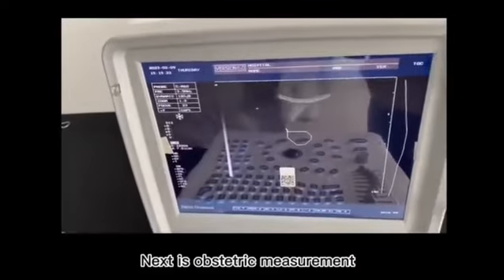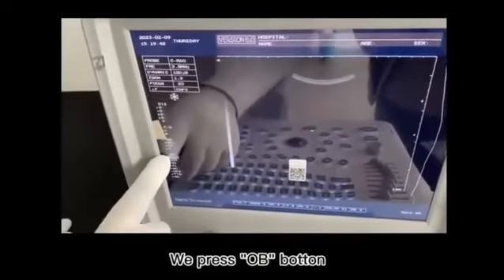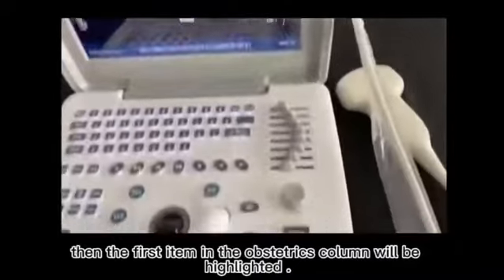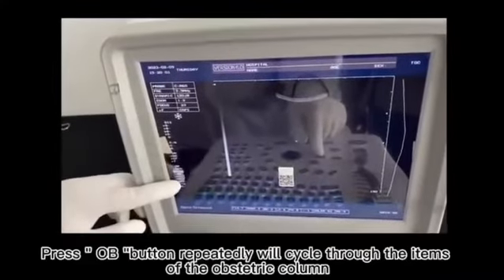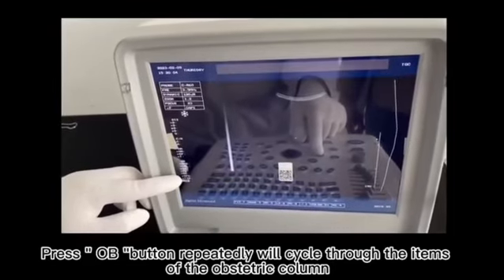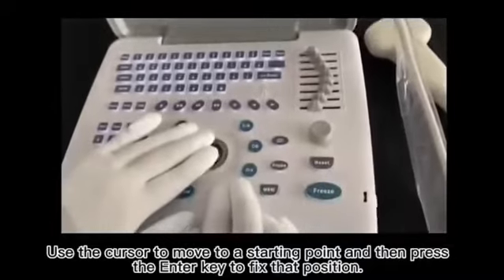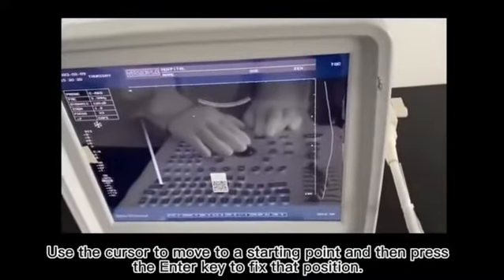Next is obstetric measurement. We press the OB button. Then the first item in the obstetrics column will be highlighted. Pressing the OB button repeatedly will cycle through the items of the obstetric column. Use the cursor to move to a starting point and then press the Enter key to fix that position.